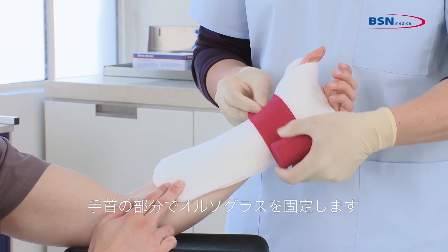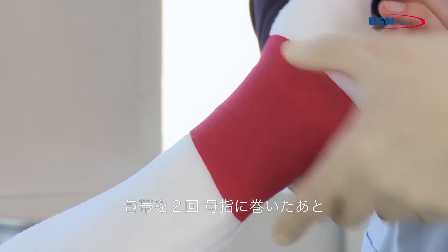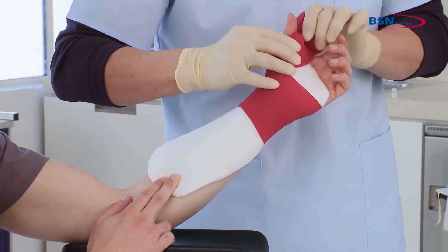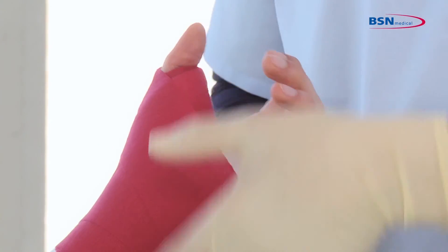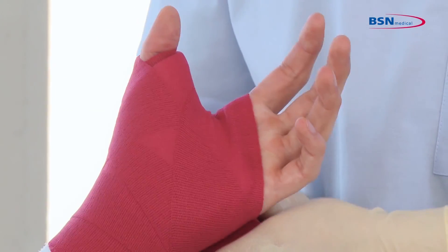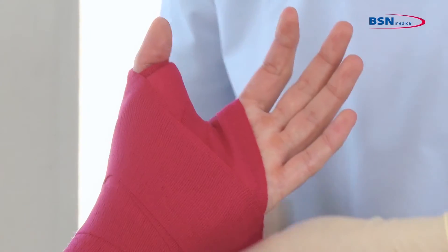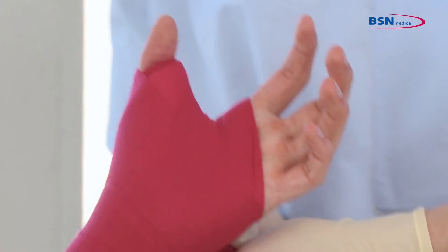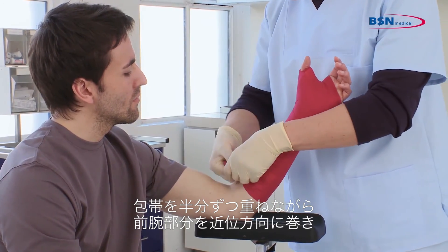Then, anchor the splint at the wrist with the bandage and continue around the thumb two times, and through the web space twice. Proceed up the arm, overlapping by 50% of the bandage.